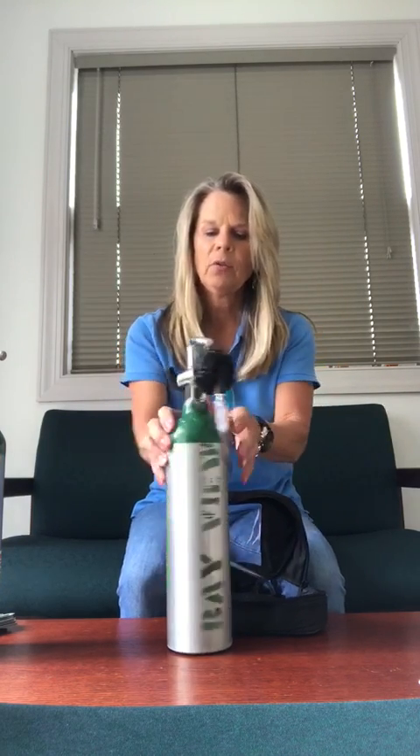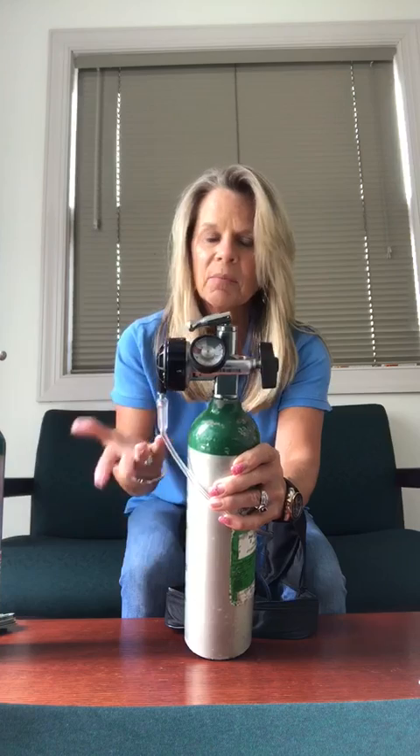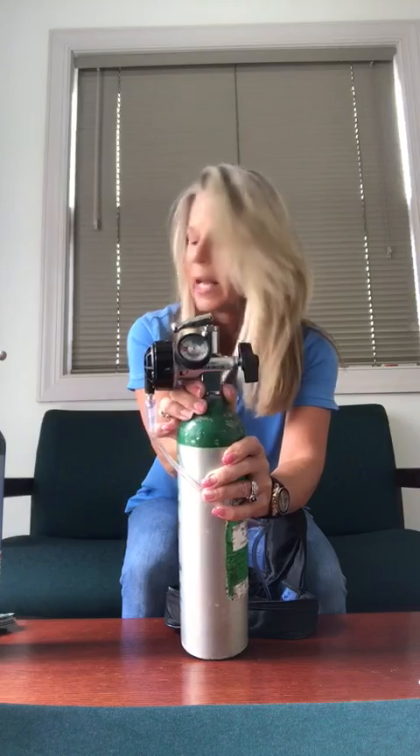If you notice that the gauge right here is in the red, that would mean it's time to change your tank. If maybe you know that you're going out and you need a fuller tank and it's maybe a little less than a thousand, which is a little less than half full, and you'd like to take a new tank, then you can go ahead and change it at the same time today.